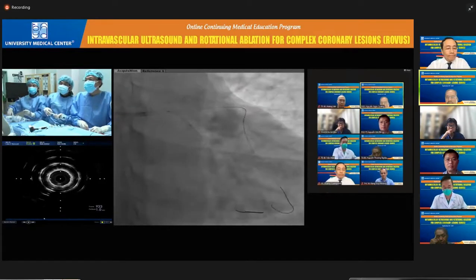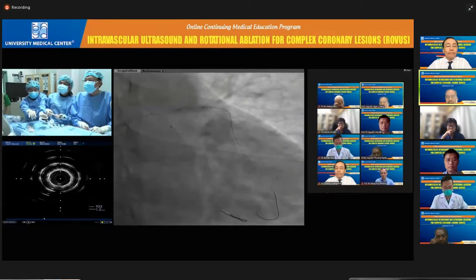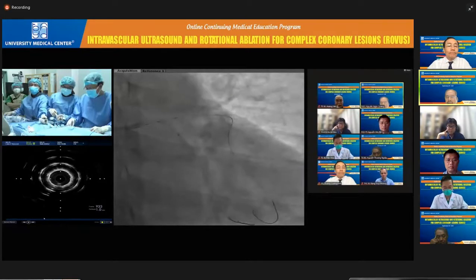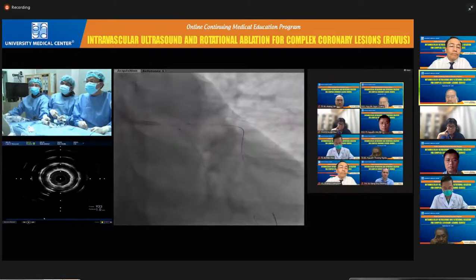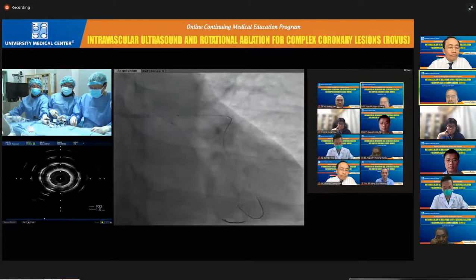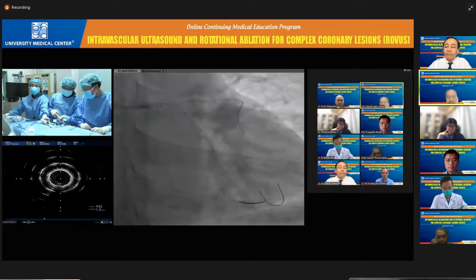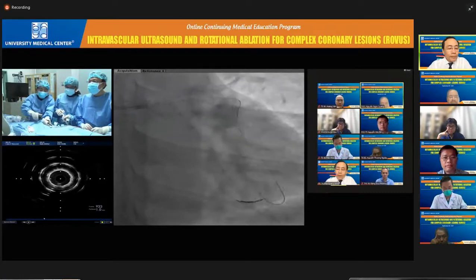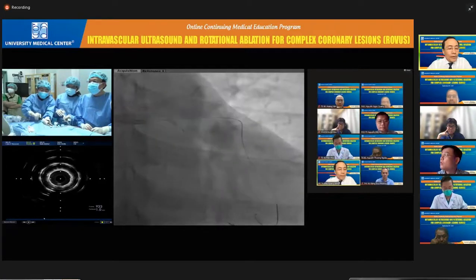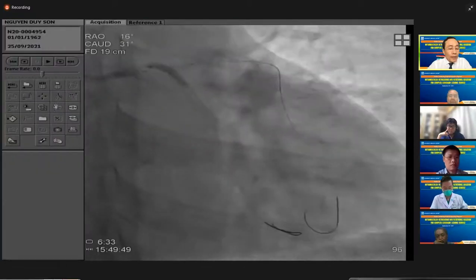Because the stent in the left main, I think it's something like a 3.0, right? So for the first kissing, we can end up with the 3.0 NC balloon for the left main. But it depends on how you go easily into the left main or not. Yeah, okay. So we can use the balloon from previous.